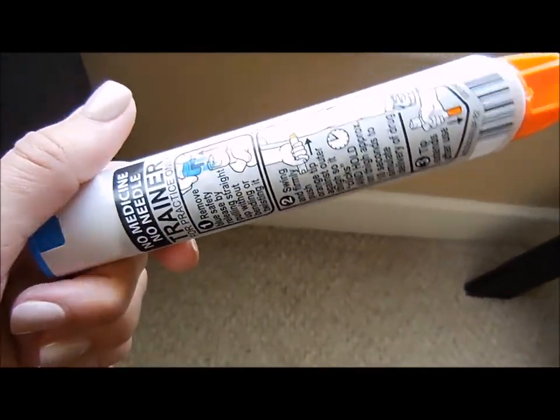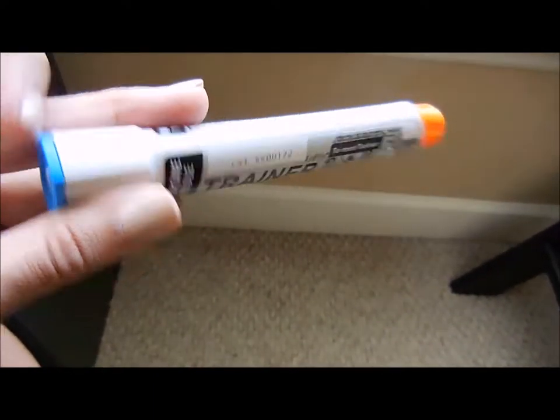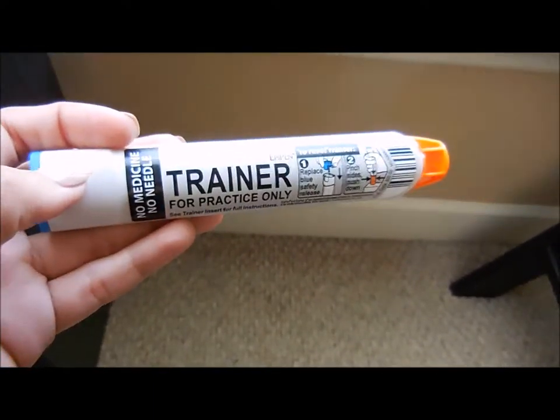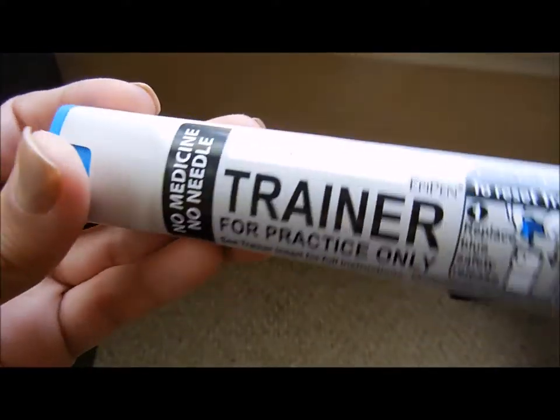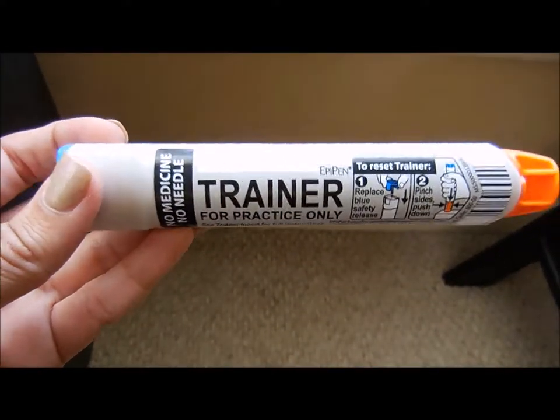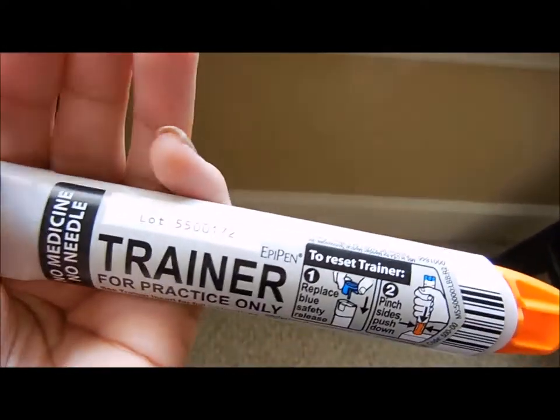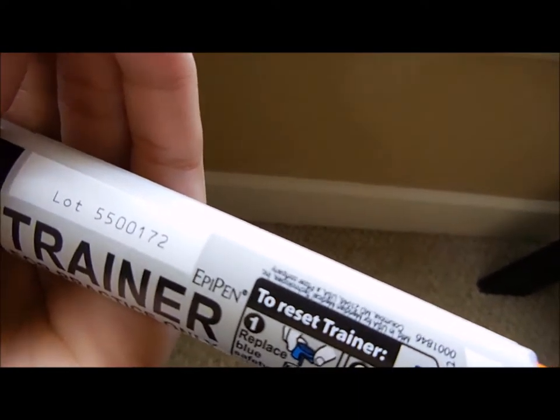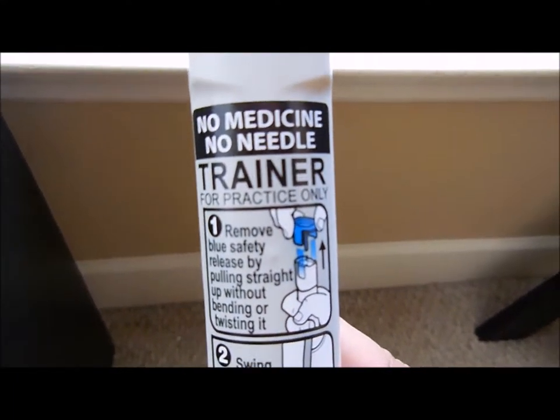This is my second EpiPen video — the first one didn't turn out great but I uploaded it anyway. I just got this and haven't used it yet, but I'm making this video for my friends and family just in case of an emergency. They can also go watch a real tutorial online. This is a trainer, so there's no medicine or needle — sorry about that.